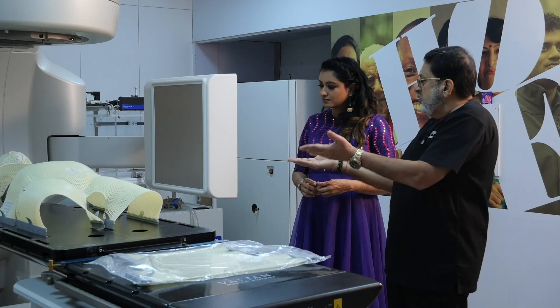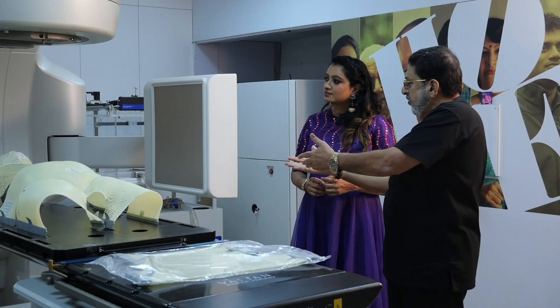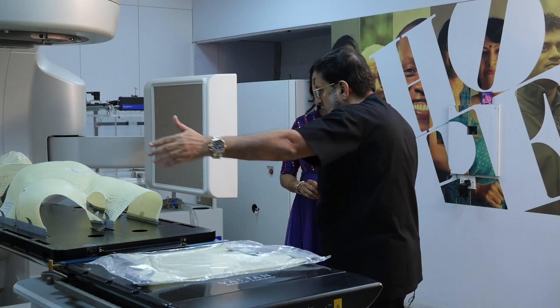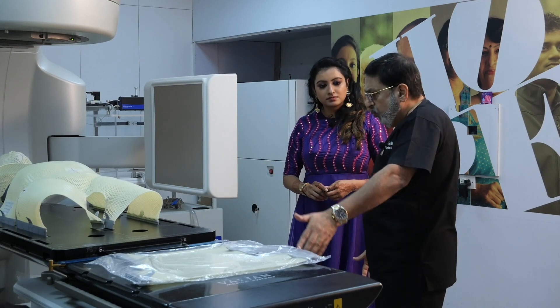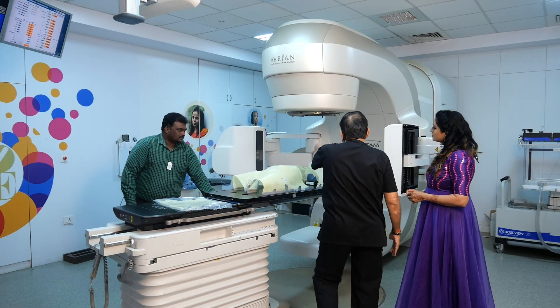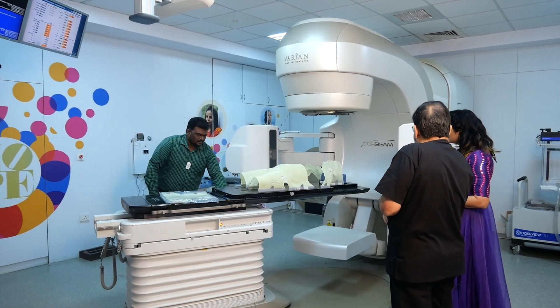Everything is computerized now. You have the couch going up and down, you can tilt the couch, and treat at various angles. You can even rotate the couch to the right or left, so the radiation goes in a particular angle rather than just a straight vertical angle. These kinds of technologies are very useful for high-end treatment.